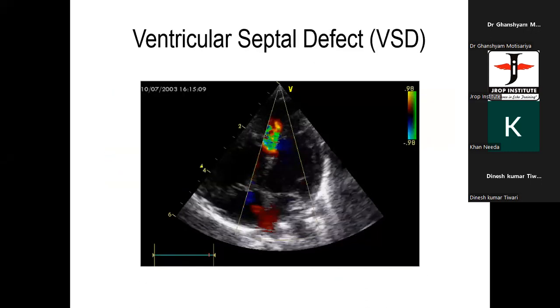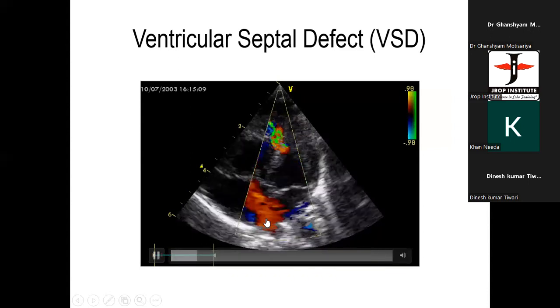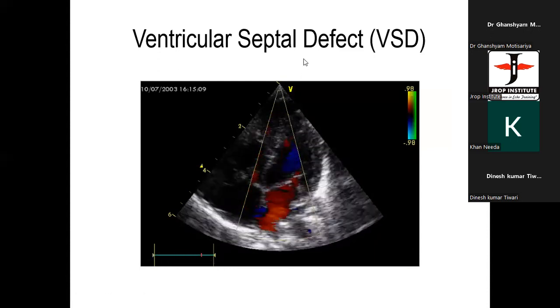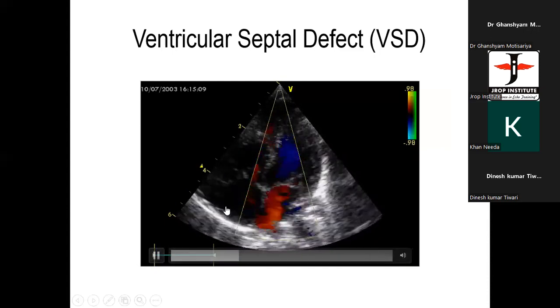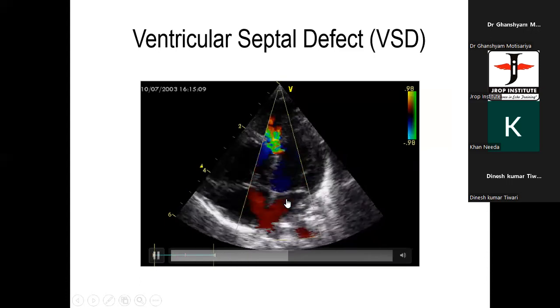Here is the answer. Look, this dropout would be very commonly seen in a four-chamber view. Does this dropout always mean presence of ASD? Certainly not. Either we switch on color or we inject agitated contrast saline into the right arm so that if there's a hole in it, it crosses over to the other side.